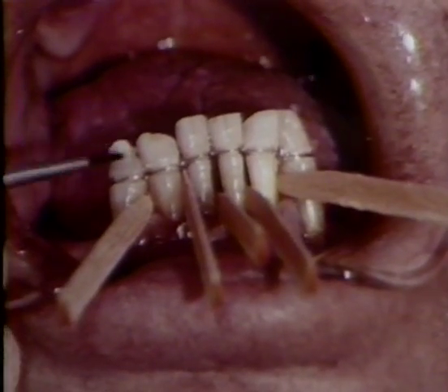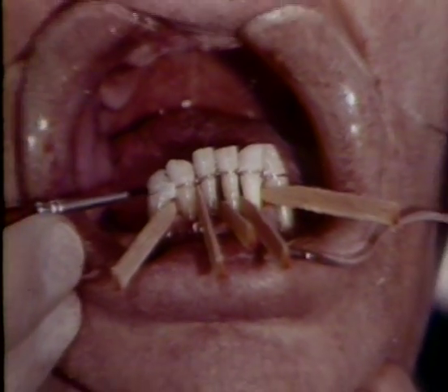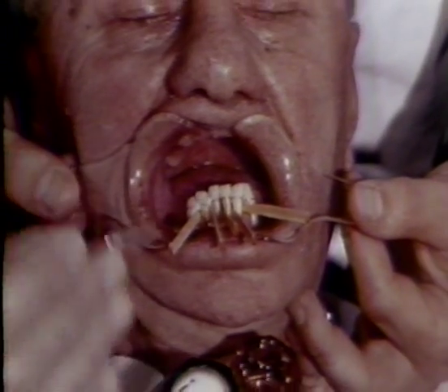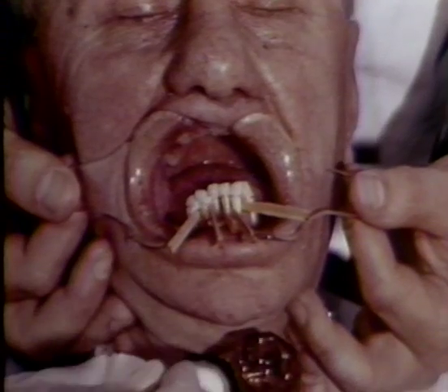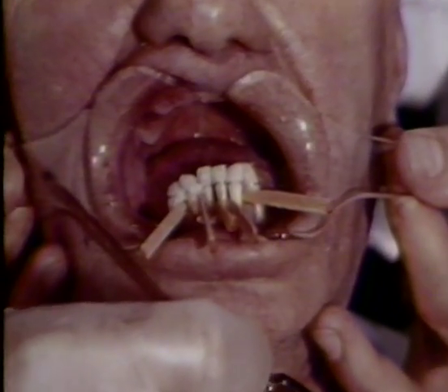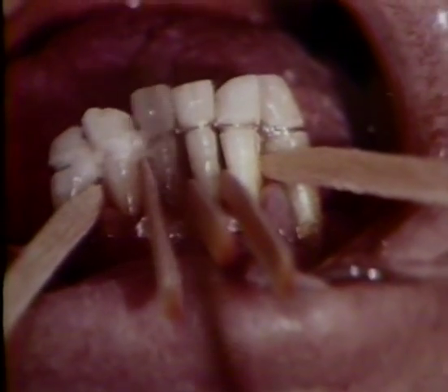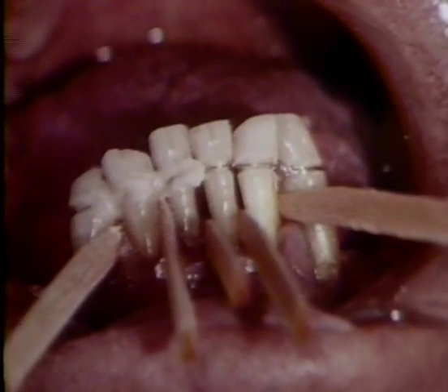Using a brush-on technique, the plastic is carried over the wires interdentally and allowed to flow labially and lingually. This eliminates the usual problem of loosening, which may occur when extracoronal stainless steel wire ligature is used for immobilization. Loosening, however, will not occur with this type of circumferential intracoronal splint.